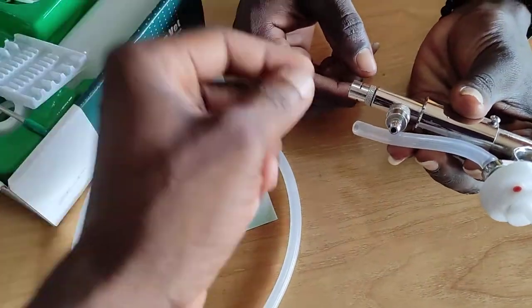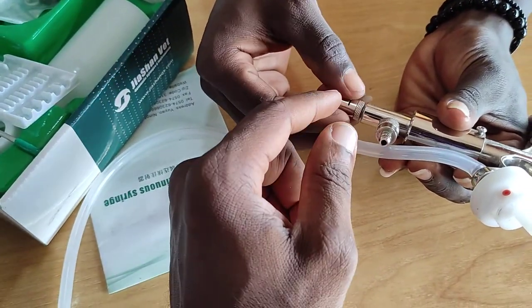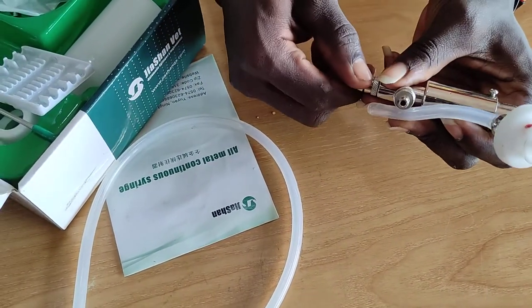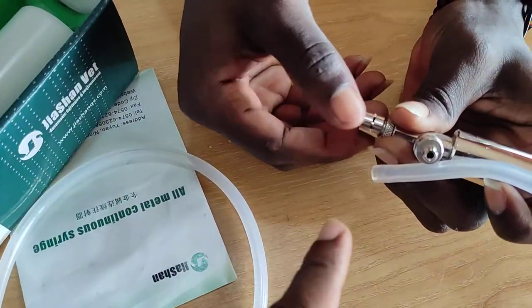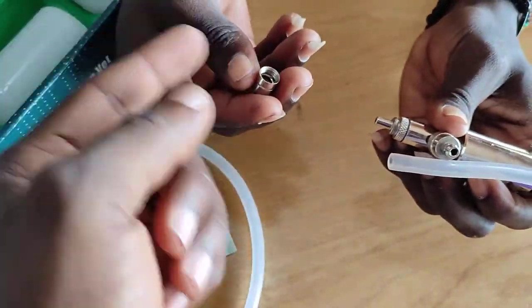We suspect he was trying to open here — open it as if you want to put a needle in — so he tightened it then opened it. This is how you open it to put the needle in: open and remove, yes, but put it back.